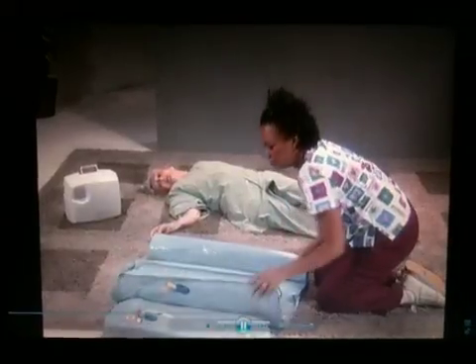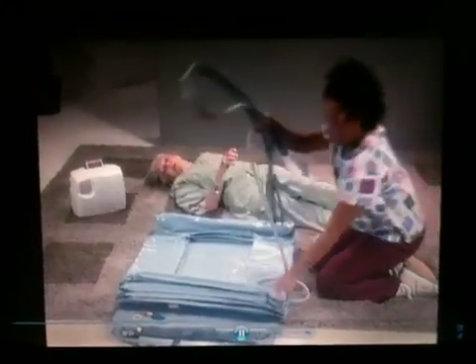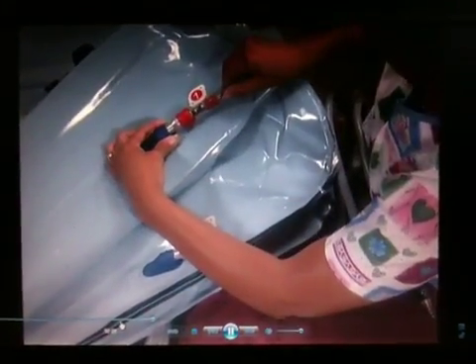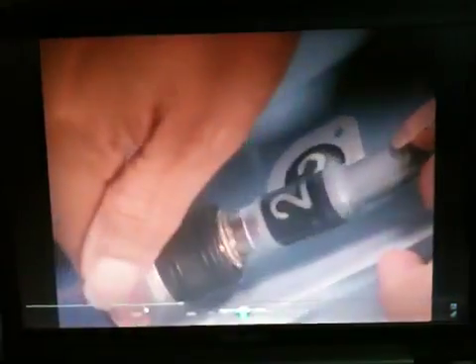The camel is unrolled and the four-way hand control is removed. The air supply lines are connected between the airflow power source and the camel, matching each air supply tube to the corresponding number and color connector. Push them together until secure.